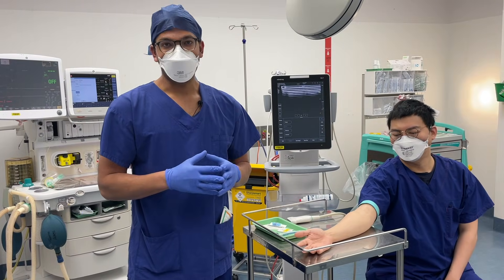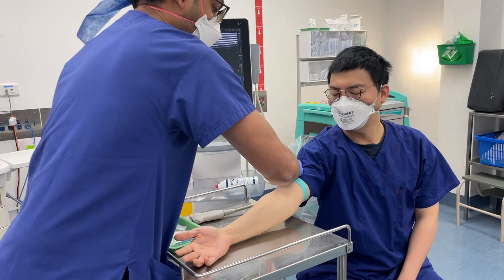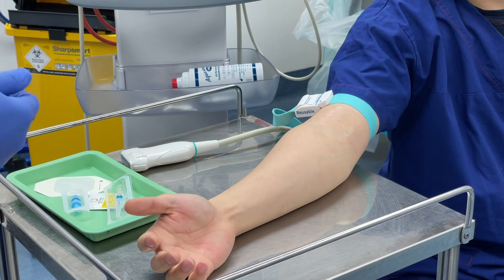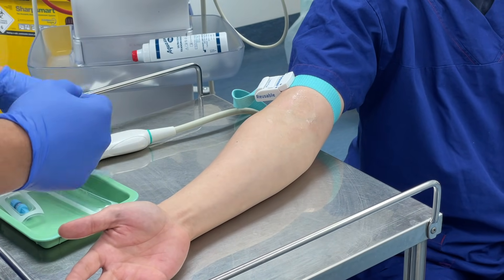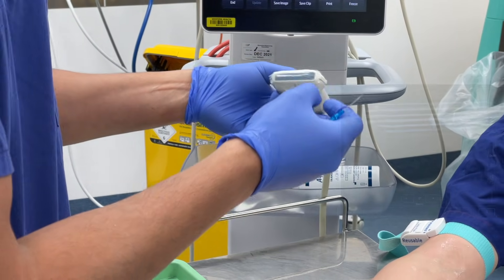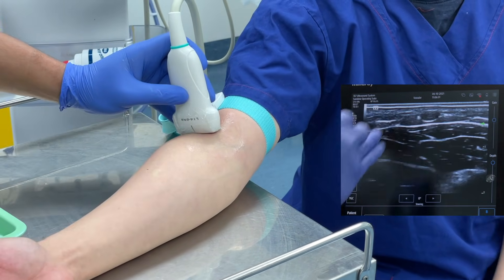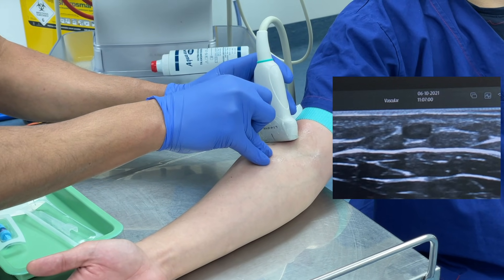Now we're going to do a real-life ultrasound-guided intravenous cannulation on a very helpful volunteer. I'll put on the tourniquet, make sure the patient is comfortable. I'll use aseptic non-touch technique throughout. I'm using a small 22-gauge cannula. We clean the surface with chlorhex alcohol solution, making sure the patient isn't allergic. I check my cannula and loosen the tip, then check the ultrasound orientation. I'm going for the lateral side because there are more dangerous structures on the medial side. The vein is visible — it's compressible and not pulsatile.